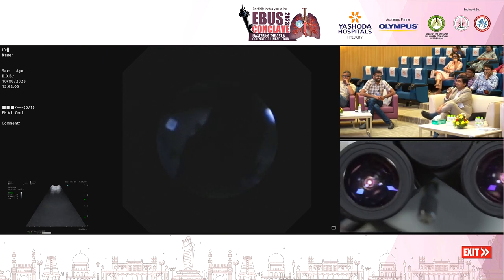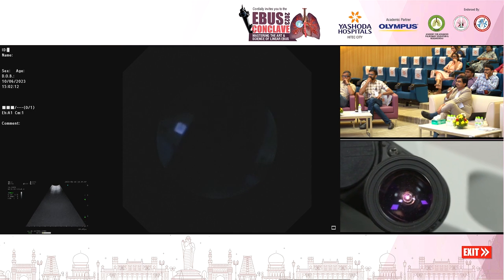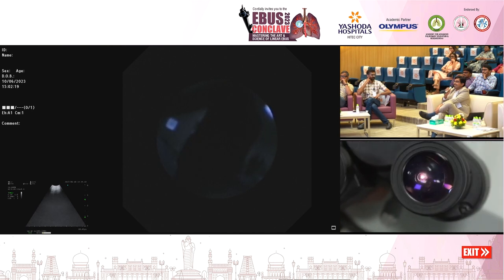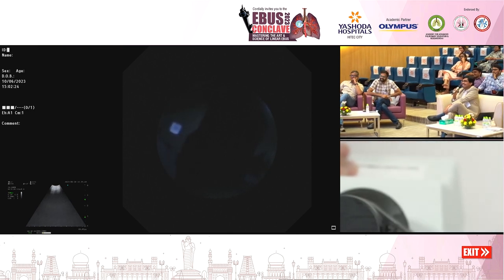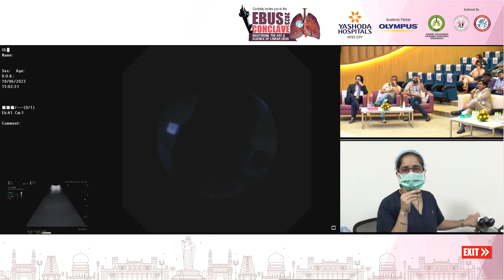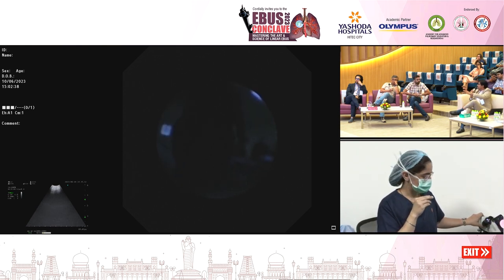Yeah, so we have a syncytial cluster of cells, which has eosinophilic cytoplasm. The cells are slipper-shaped, elongated. Any diagnosis on the description? Granuloma. So yes, it is a granuloma for us. But there is no necrosis in the background. So we have seen the imprint smears as well as the smears which are prepared from EBUS FNA. I think the beauty of this thing is that the first pass itself sometimes gives the diagnosis.